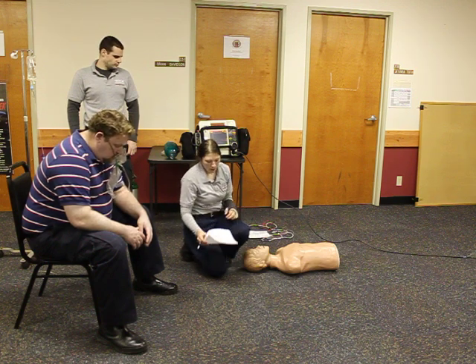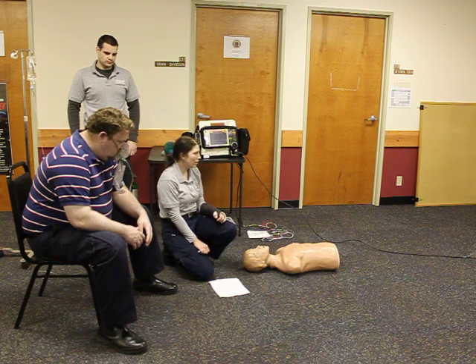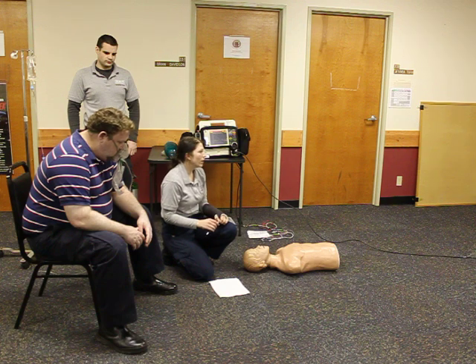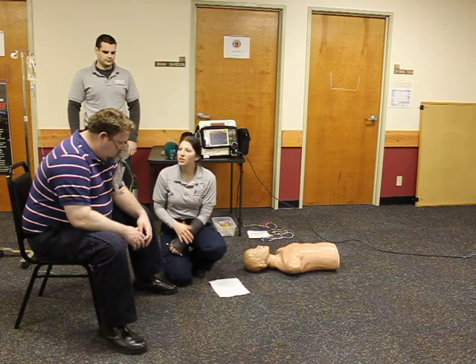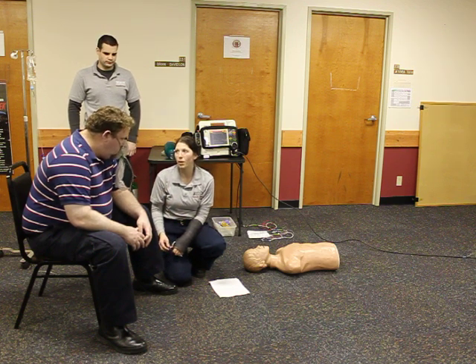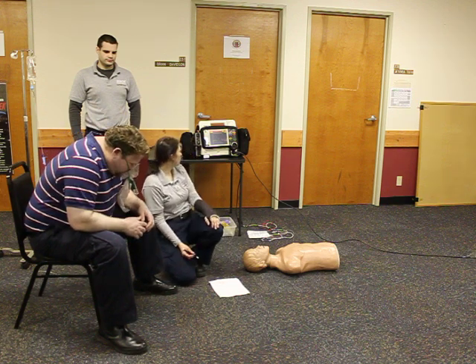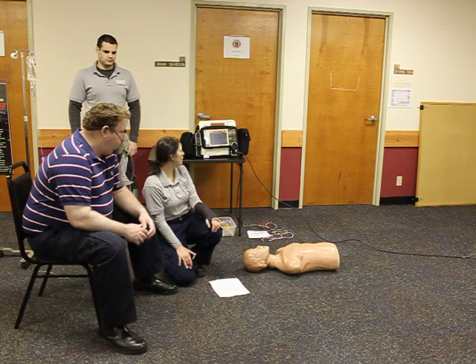Okay. I noticed on the monitor that my patient is in SVT. I would like to start by performing some vagal maneuvers. Sir, I'm going to need you to take a deep breath, and then I want you to bear down and push like you're taking a bowel movement. Do I notice any change? I still see SVT.